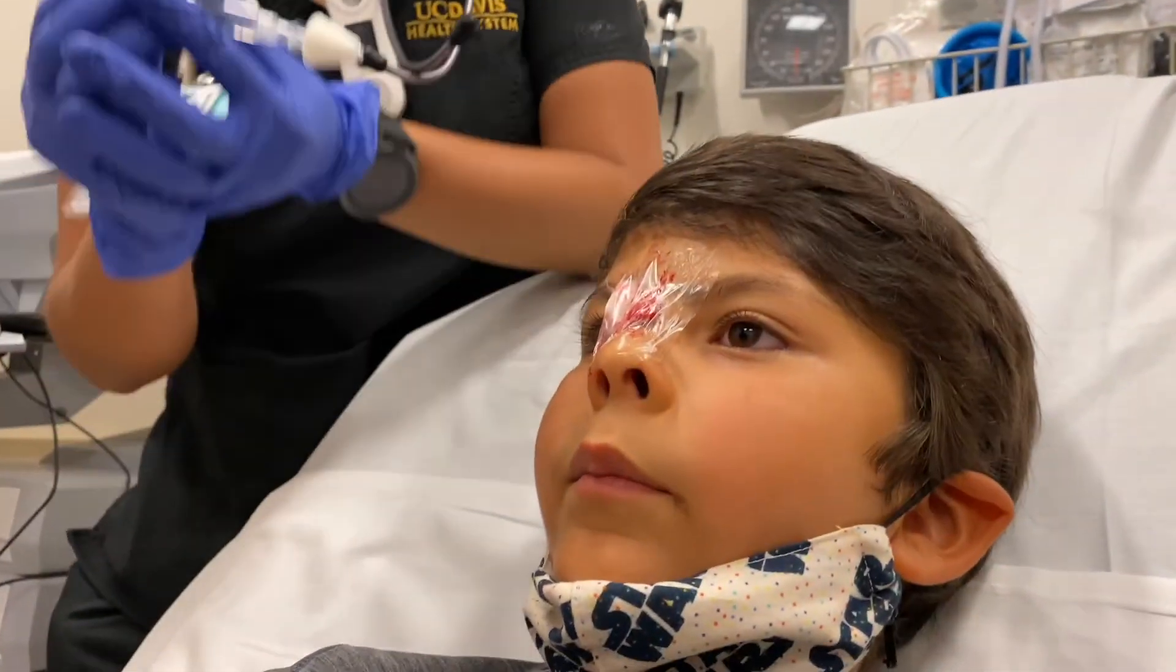Okay, now that we're all dressed up and we've got the child stabilized, you want to make sure that mucosa is available. So suction out any snot or blood, anything that's going to keep that medicine from getting to the mucosa. And you sit the head of the bed back to about 45 degrees so the medicine doesn't just drip down the back of the throat.